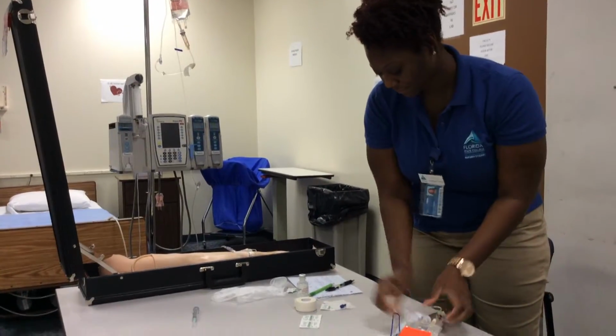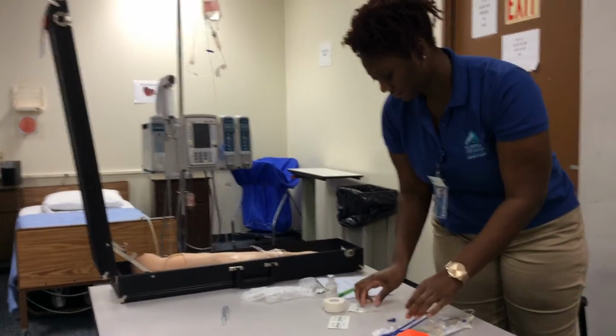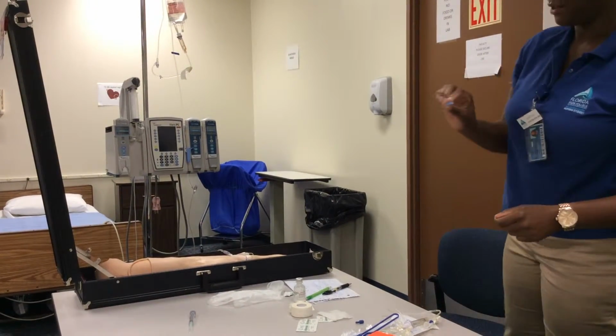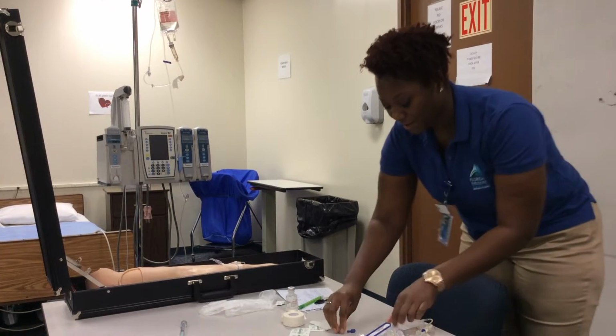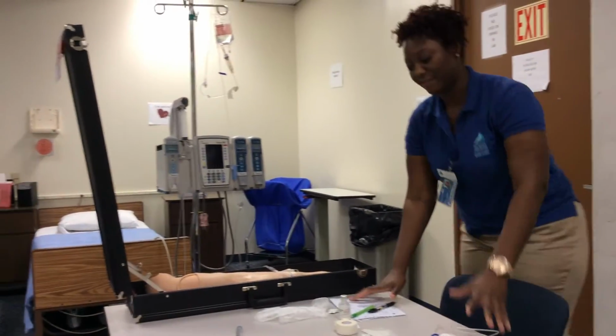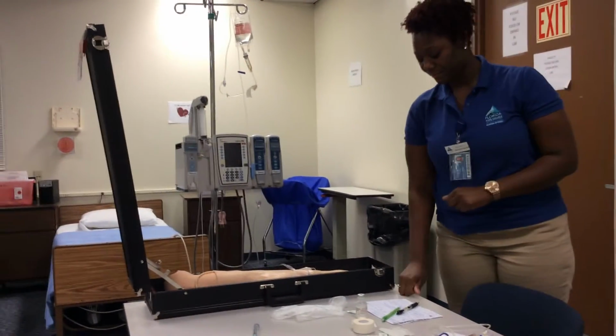Alrighty. So now I'm ready to go in the patient's room. So I'm going to pick it up, but it will be sterile. If this fell on the ground, I will get a new tubing. I have my MAR. I gathered my MAR and all my equipment. So now I'm ready to go in the patient's room.